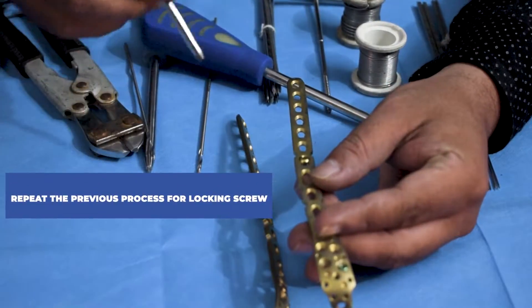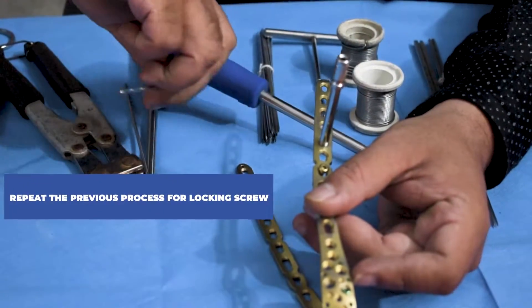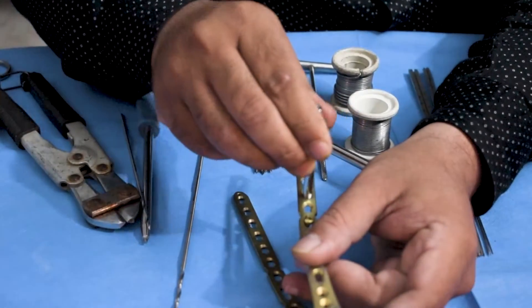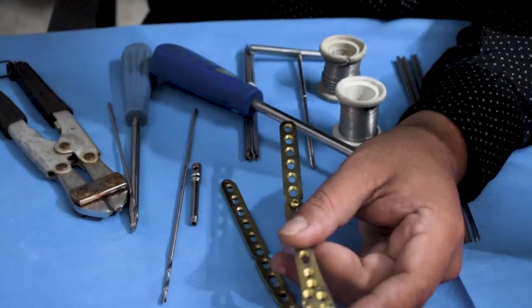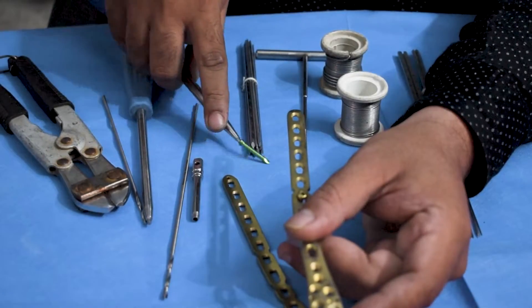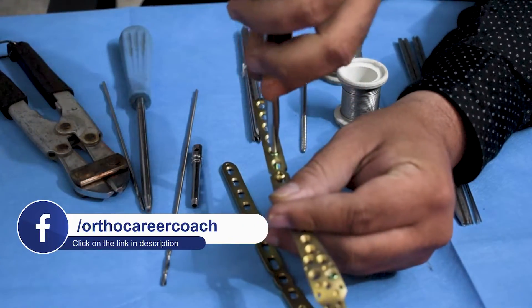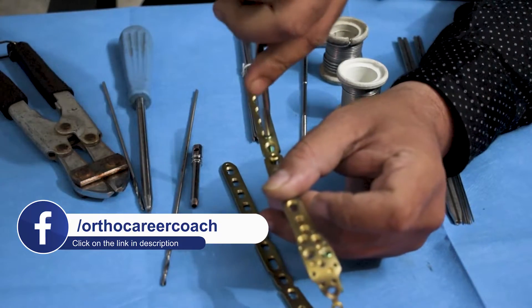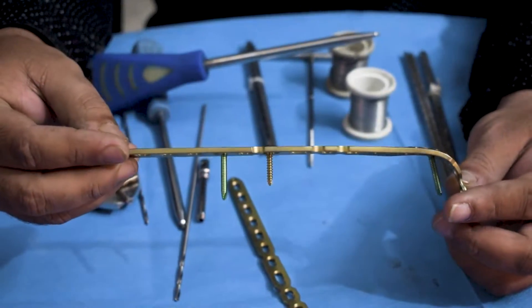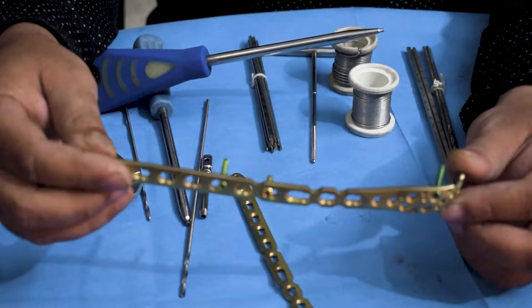When you want to fix a locking screw, you repeat the same process of attaching the locking sleeve first, after which drilling is done through it in the same way. Note that for fixation of a locking screw, tapping is not required. This is how you fix a pre-contoured plate in case of an olecranon fracture, which helps in joining and healing of the bone.